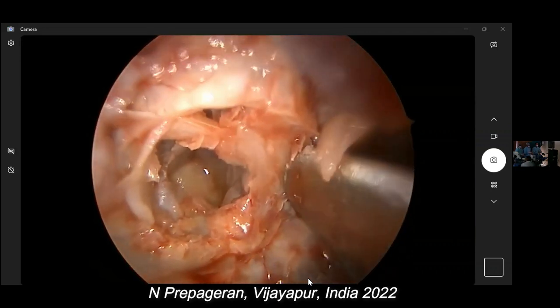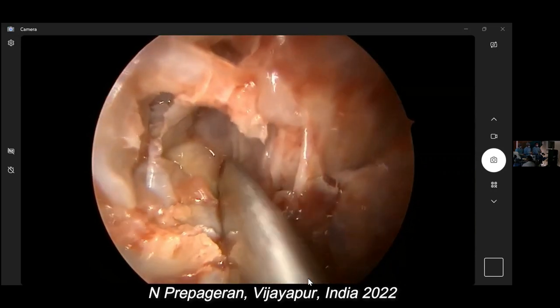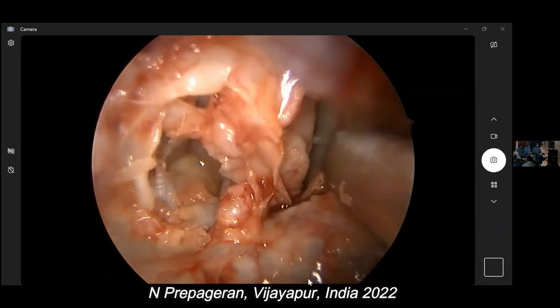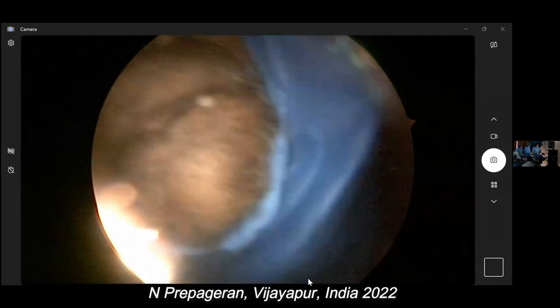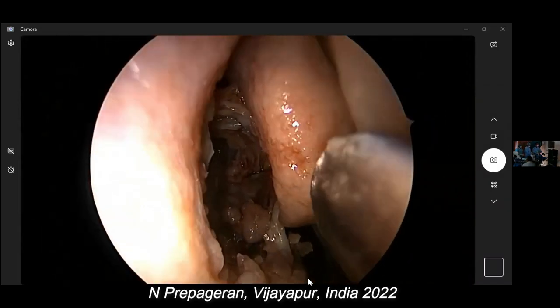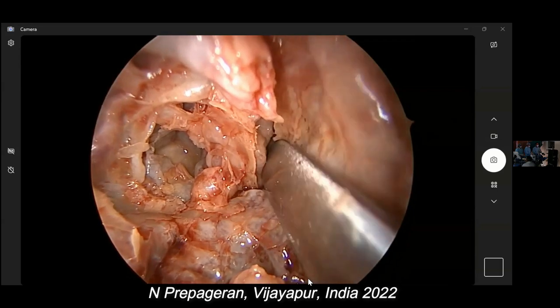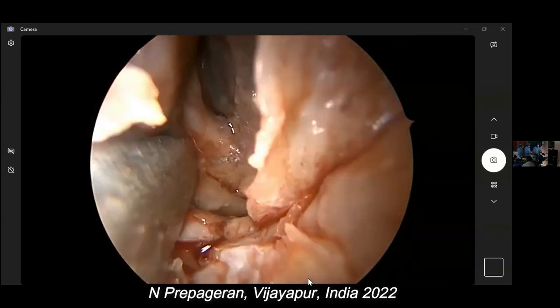Now, gate number four is the anterior wall of the sphenoid sinus. How do we know we are in the posterior ethmoids? All you need to do is dissect here and identify the superior turbinate. Can you see? If you have identified the superior turbinate, then automatically you know that we are in the posterior ethmoids. So if you push the superior turbinate medially, you will be able to identify the sphenoid ostium.